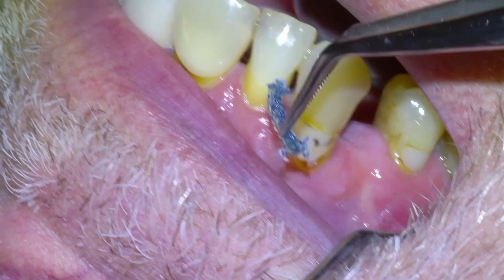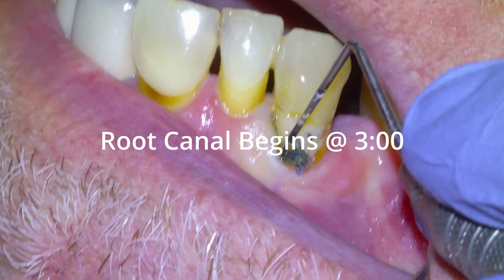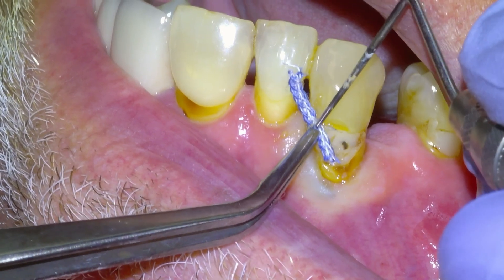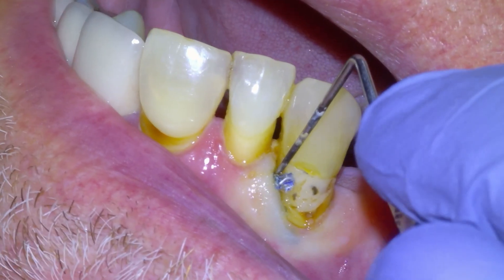There was also a little bit of decay on the buccal aspect of the tooth under an old composite, so we decided we're going to replace the filling before the root canal. If you just want to watch the root canal it begins at three minutes. For the filling, I'm going to begin retracting the gum tissue to get access to the margin of the healthy tooth with a couple of size 1 cords, packing it in with a periodontal probe.